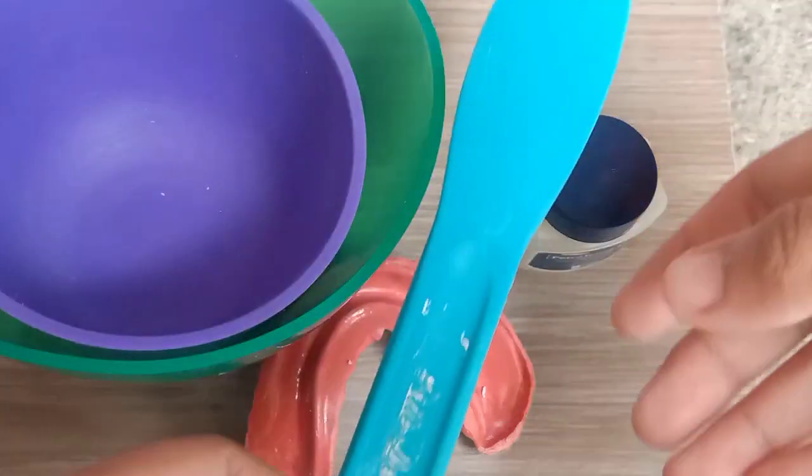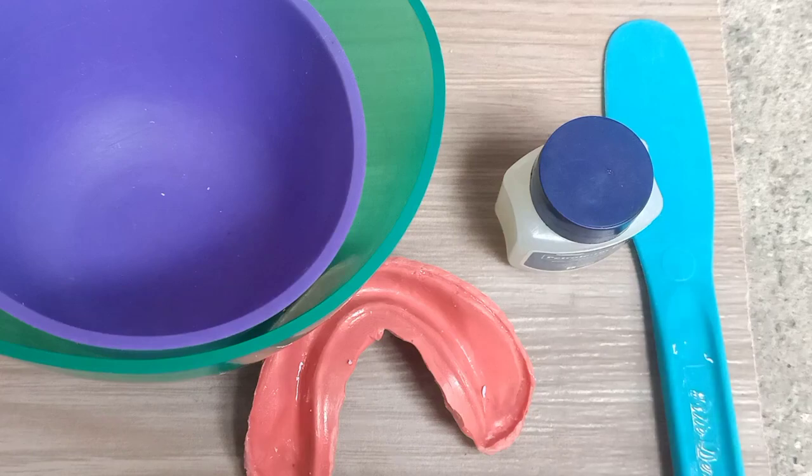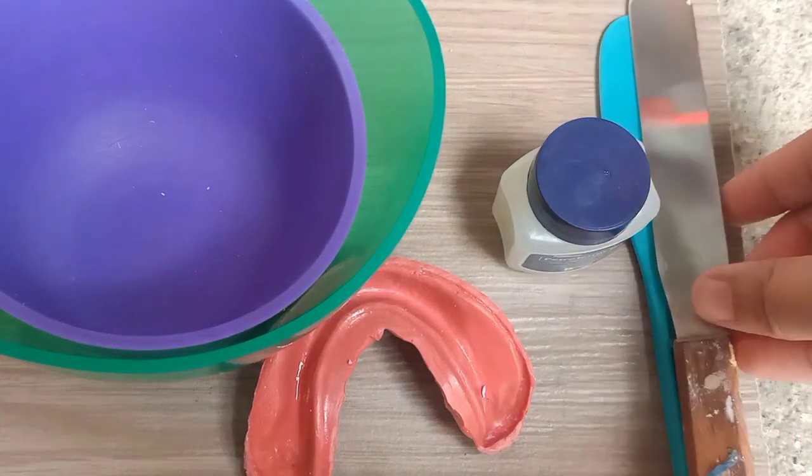I am going to teach you how to do the alginate boxing technique. These are the materials we needed.